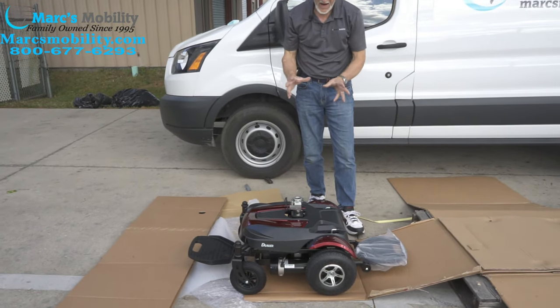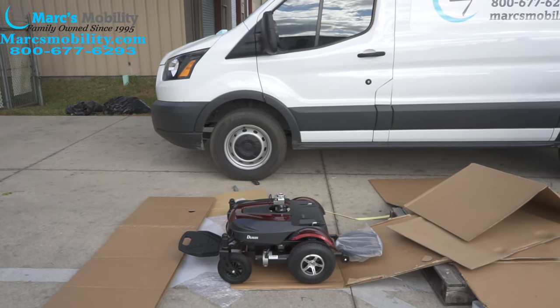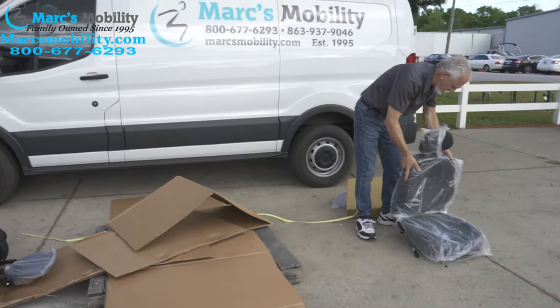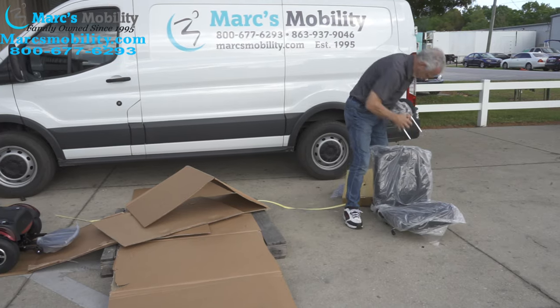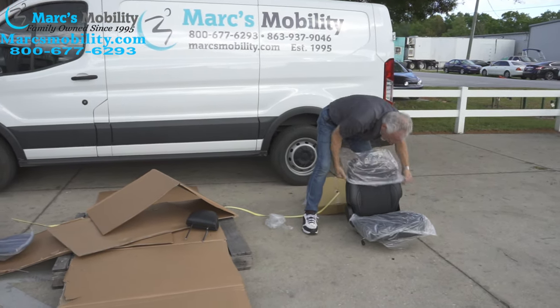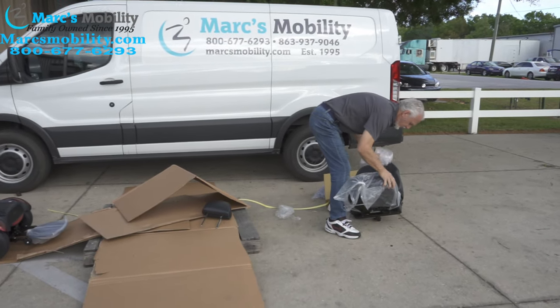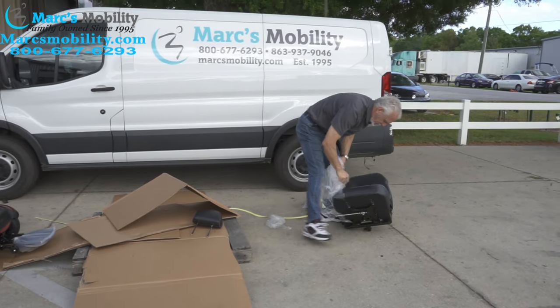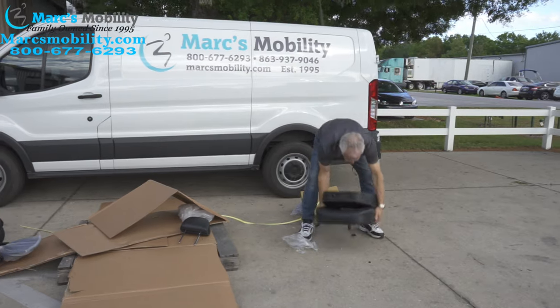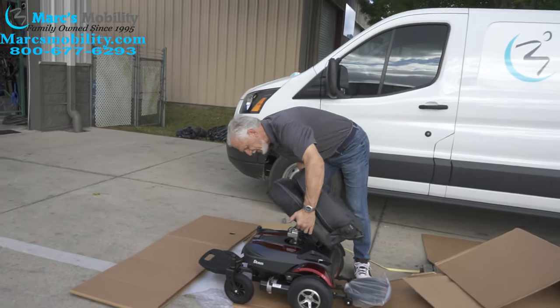Now we've got the chair, we have power, everything's connected. What we're going to do now is take our seat. I'm going to take the plastic off the seat while I'm at it. I'm going to take the headrest off and do it the right way — take the plastic off. Pull the plastic off the back. This is a Captain's seat, so I'm going to fold it down for now so you can see the bottom. You're going to bring this chair and put the seat on the post — it'll slide right down.